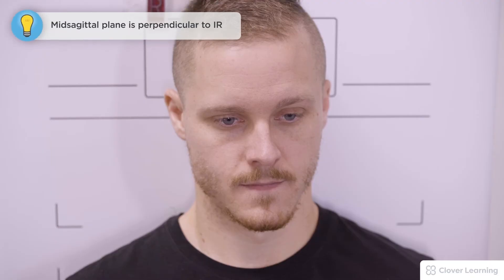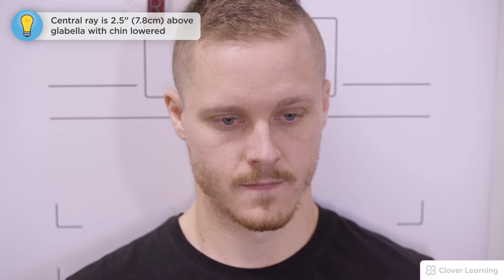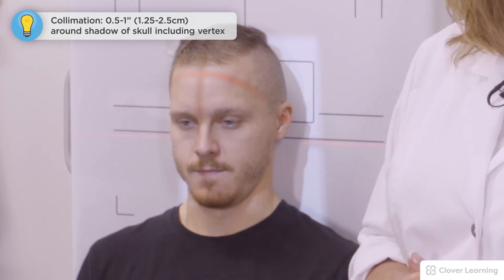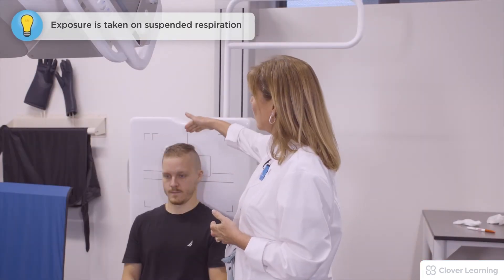We want to make sure that he's lined up well with the mid sagittal plane. The mid sagittal plane forms a perpendicular plane to the IR. The central ray is two and a half inches above the glabella when he lowers his chin. Our collimation is a half an inch to an inch around the shadow of the skull, making sure that you have the superior vertex in the shadow. The patient has a right marker and is going to hold really still, and the exposure is taken.